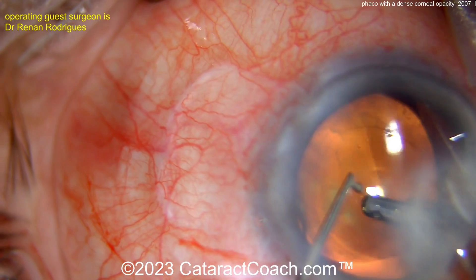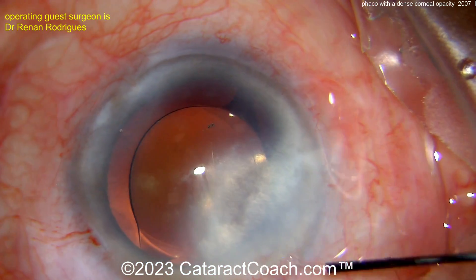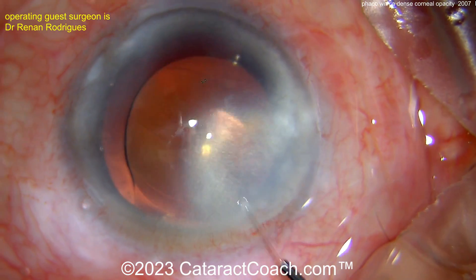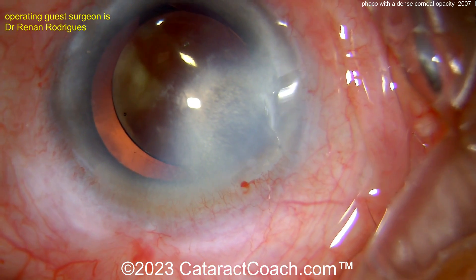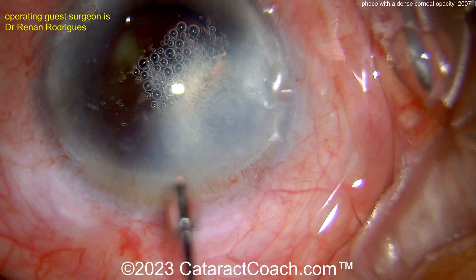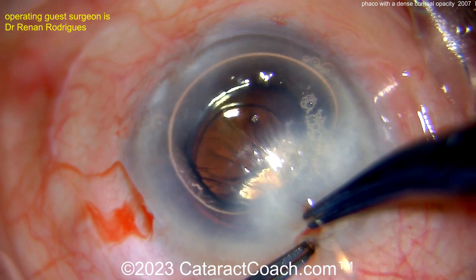Patients like this will surprise you. I've done many surgeries where just doing the cataract surgery is enough to give them very satisfactory vision. Now at the end of the case, you want to hydrate the incisions — but remember, that cornea may not be totally normal where the incision is, and you may not have great endothelial pump function there. It may not seal very well. The better part of judgment is to put a suture in. Here the surgeon did some hydration — and there's iris prolapsing. That's a definite sign you want to put a suture in. Reposition the iris, sweep from the side port in the sub-incisional area to make sure no iris is coming up to the incision. Remember, the iris is kind of like the omentum in the abdomen — when there's a leak, it plugs up the hole. Make sure there's no iris trapped in that incision.